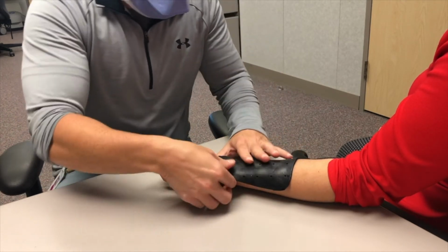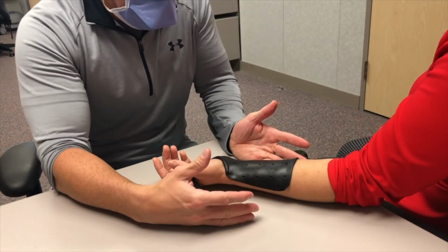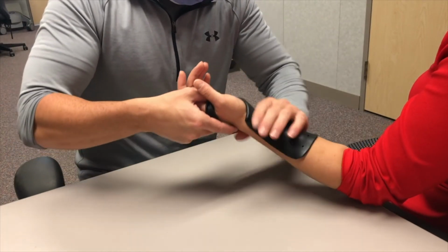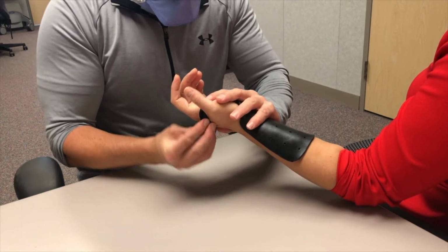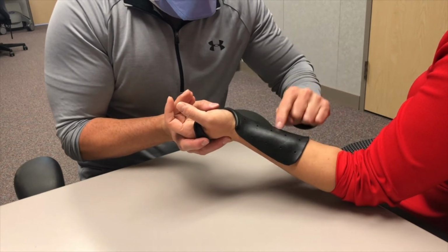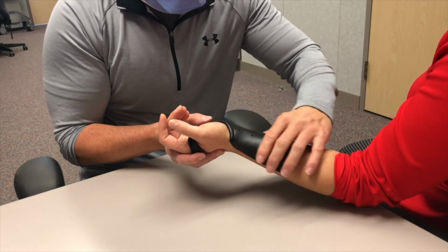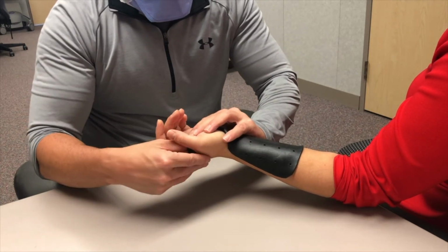Now, there are many ways you can make a splint. You can use this way where gravity is assisting. You can also use a tensor band around it. You will decide which way you like to use it or how you like to fabricate and what's most user-friendly for you. The main thing is don't be pinching your material, leaving fingerprints and indents because that can become a pressure spot later, as well as it doesn't look professional.